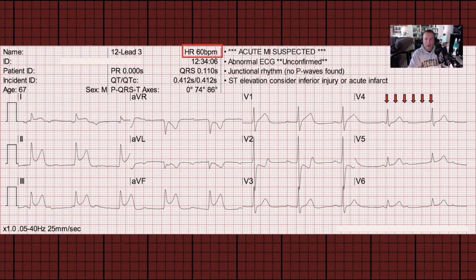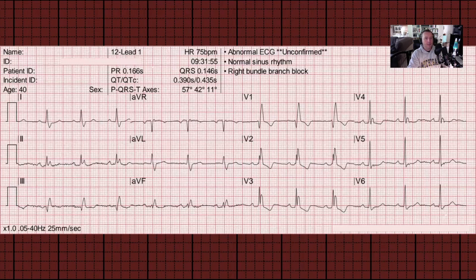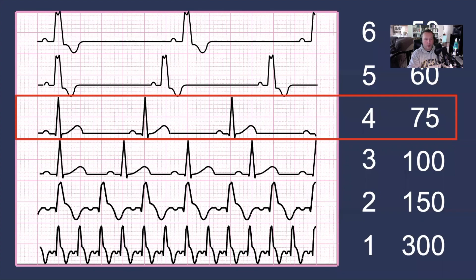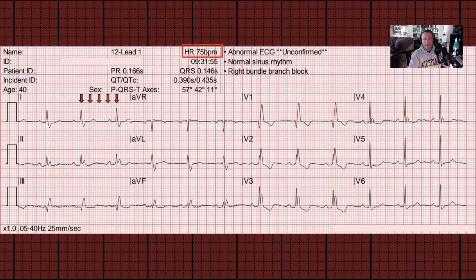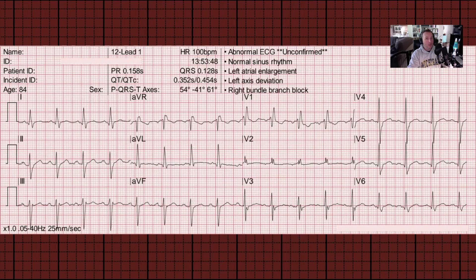Let's try 75. For 75, we should have four large blocks in between R waves. Looking at this ECG, starting right here in lead I because it lines up nicely with a large block, we count out one, two, three, and four, proving that the heart rate on this ECG is correct at 75 beats a minute.